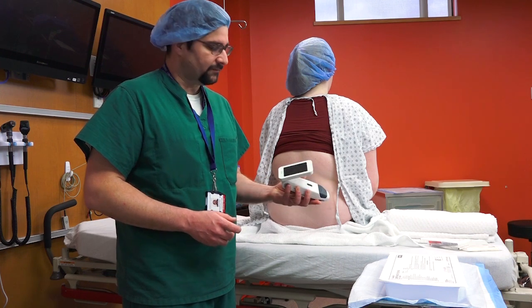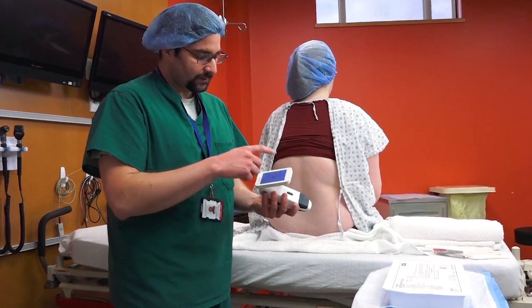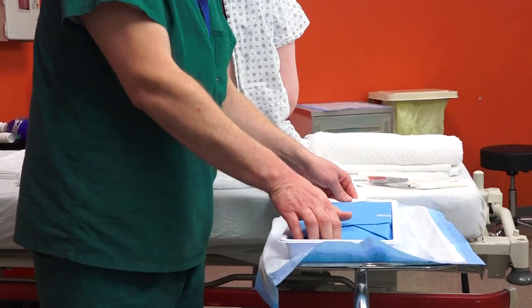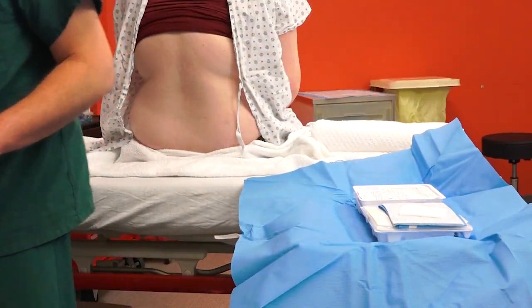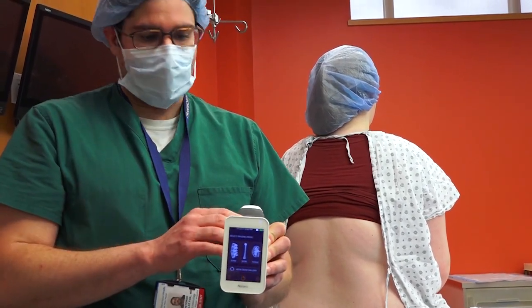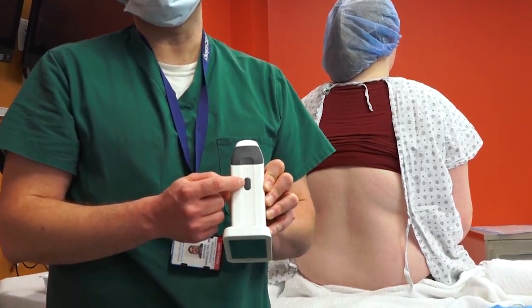I turn on the device by hitting the on button and wait for the system to reboot. While I do that, I usually start opening my epidural tray. By this point the system is already on, and I can put it in sleep mode while I finish prepping the rest. You put the system to sleep by hitting again that on button.